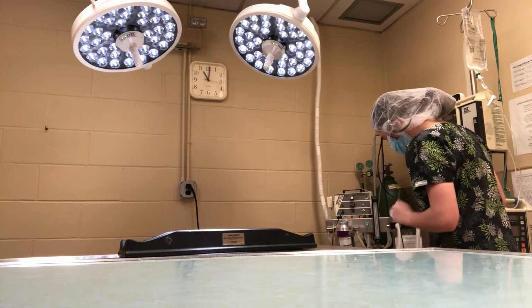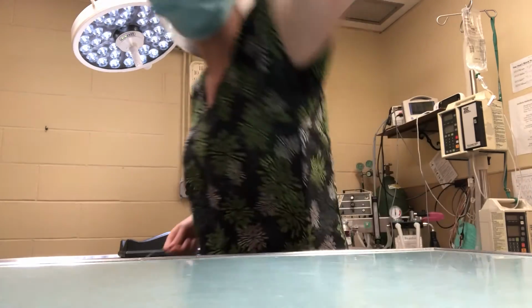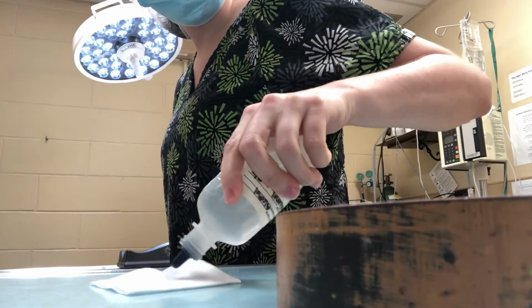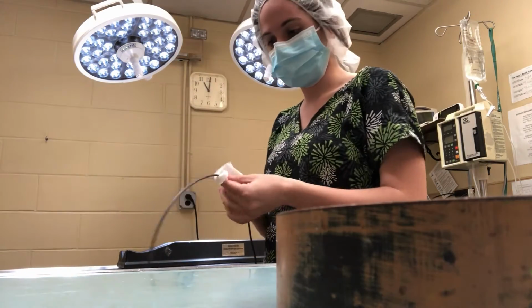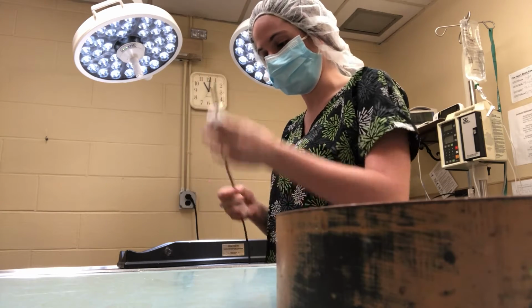And for our temperature probe, not only is it on the ground, but it was also used on a patient. So we're going to go ahead and clean that with some alcohol. And then hang that up so it doesn't get dirty again.